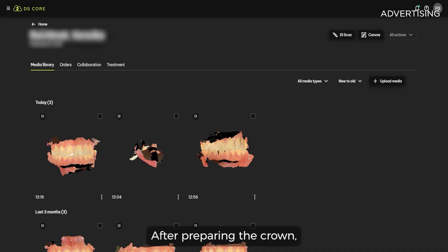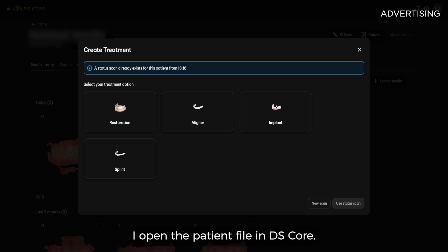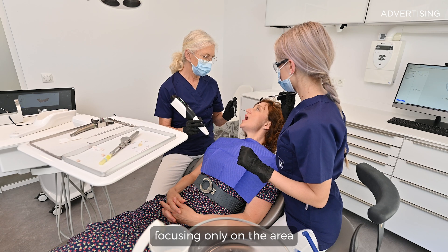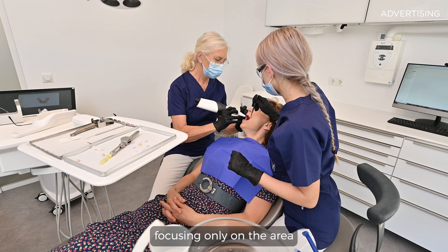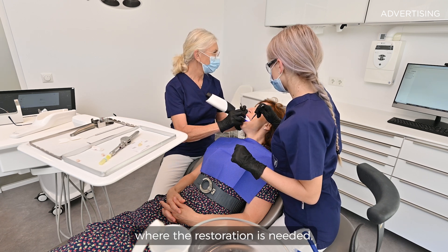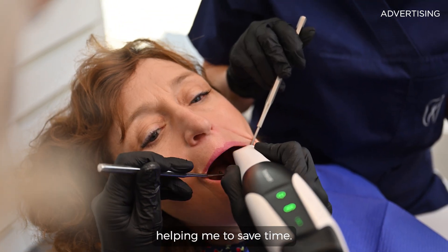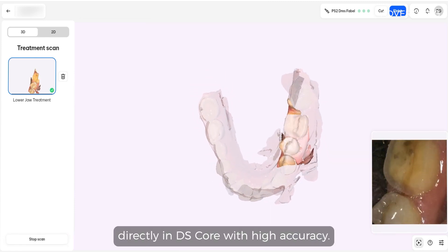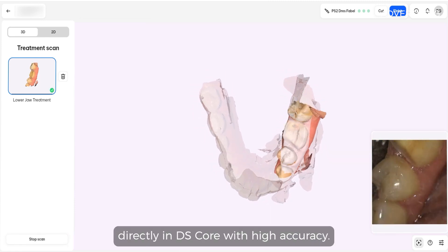After preparing the crown, I open the patient file in DS-Core. I take the treatment scan focusing only on the area where the restoration is needed, helping me to save time. As you can see, the scan is being captured directly in DS-Core with high accuracy.